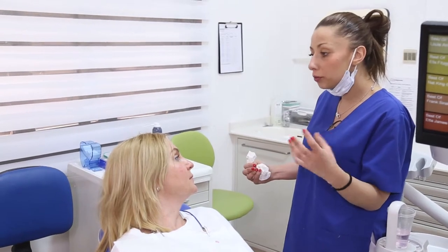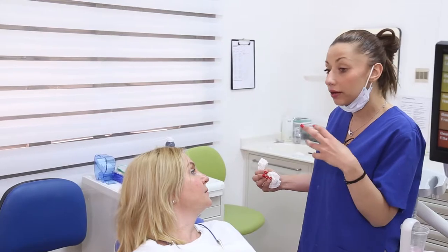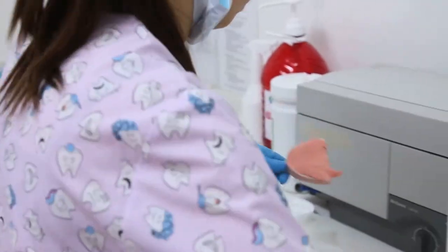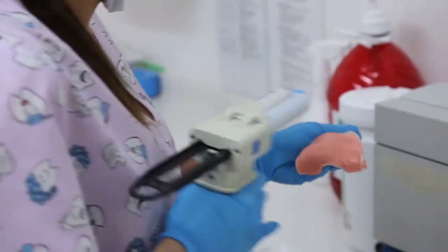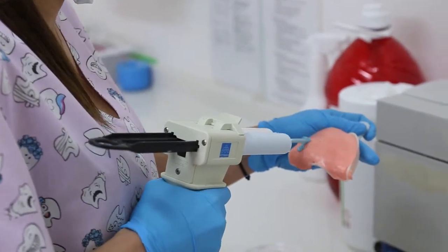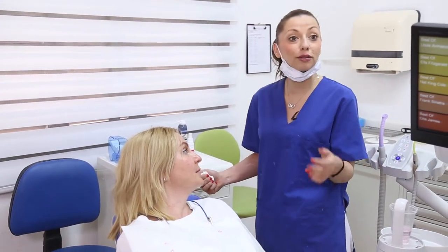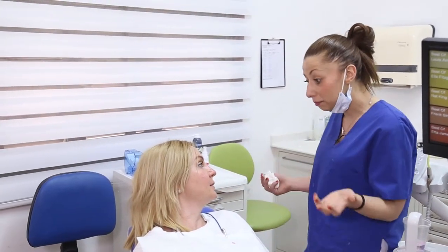In oral health, it's good to compare not only the size and the shape of the teeth, but they are more beautiful when they are together one color, even if it's not so white. You also have your temporary teeth on your upper jaw that helped us to avoid any sensitivities during your trip. So now we are ready and we are waiting for our laboratory to prepare our permanent teeth.